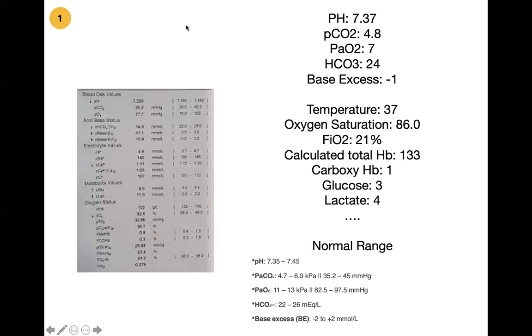So great job, both of you. This is type 1 respiratory failure, and this is how I would approach it. One thing to say is there are loads of really good resources on Geeky Medics and other places about how you approach it, and people say what to look at first. There are good techniques, and you might think about pH, but find one that works for you and stick to it, because it does give you lots of information. And as long as you're comfortable going through it, that's okay.